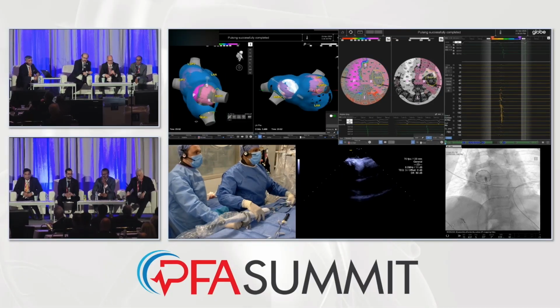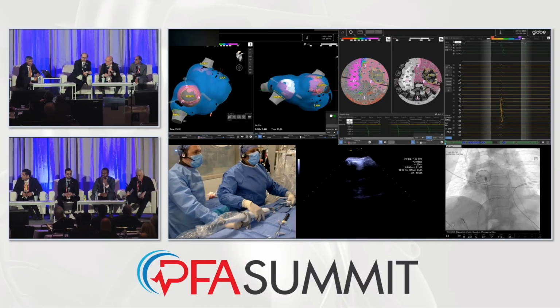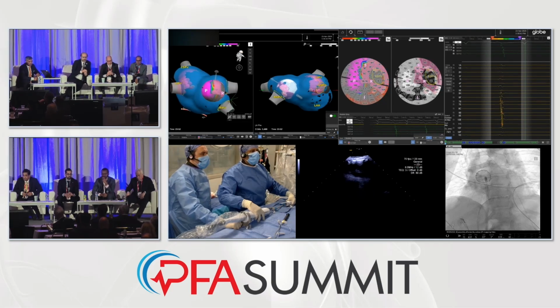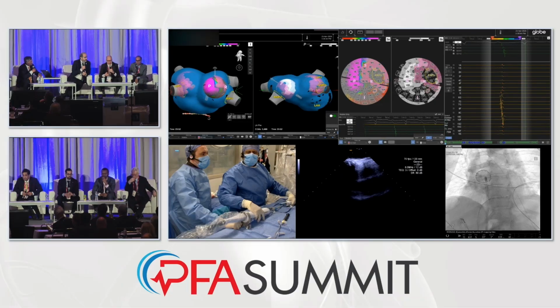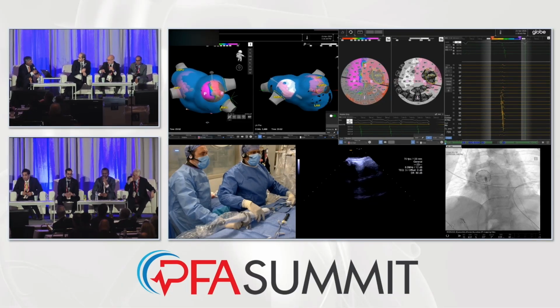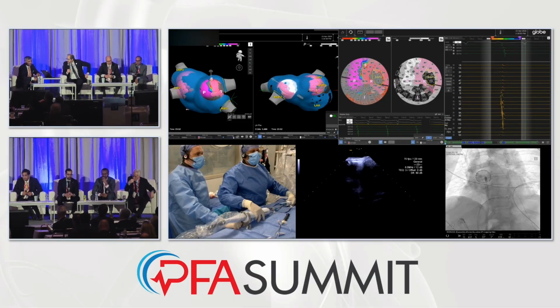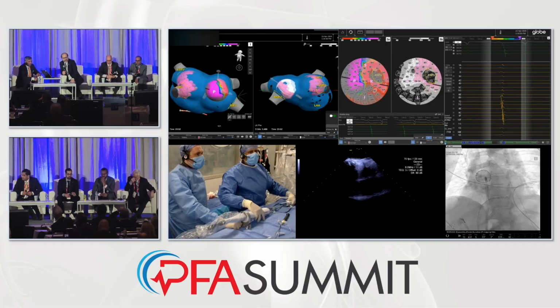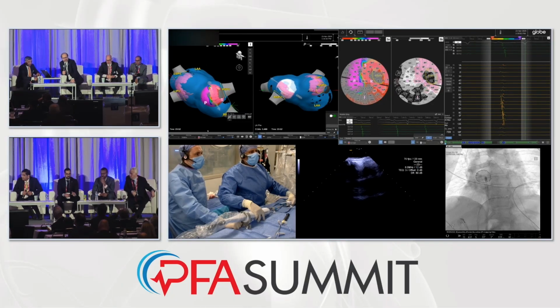As long as you're pushed up against it, you pick the electrodes that happen to be touching. What is the pulse duration? How long does it take? How many applications do you deliver in each vein, or is it one? It's a train of 6, and it takes about 35 seconds to deliver. Now, if you decide to do the posterior wall, you cut that down to 3. So instead of a train of 6, it'll be a 3.